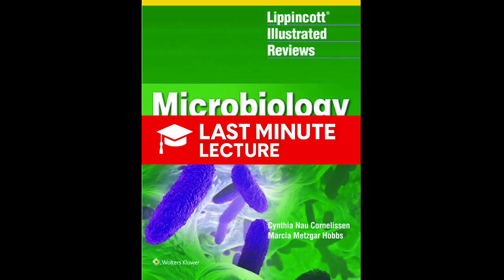But that's just a yes or no. The book also talks about the MIC. The minimal inhibitory concentration. This gives you a number. It tells you exactly how much of the drug it takes to stop the bug from growing. And why is that number so important?